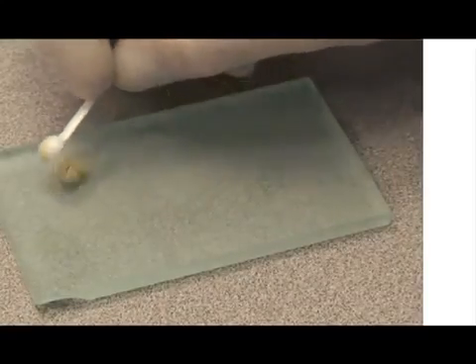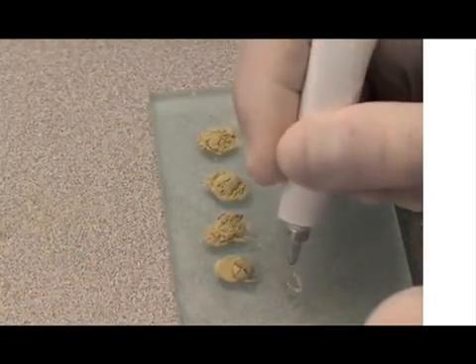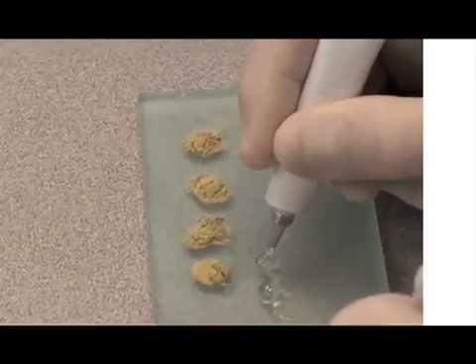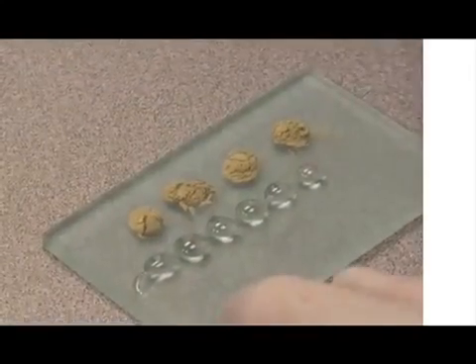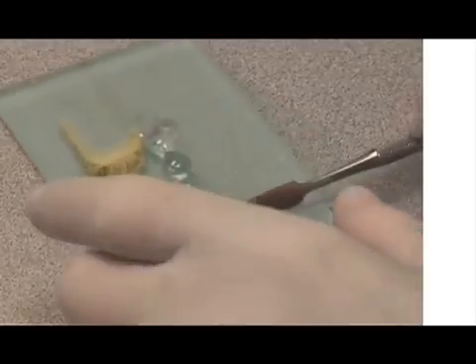As you see, I place 4 scoops of powder and 6 drops of gel. This makes a mix that has low viscosity, no granularity on the surface, and a sheen to its surface. The 2:3 ratio of powder to gel makes a flowable cement that has high radio opacity.